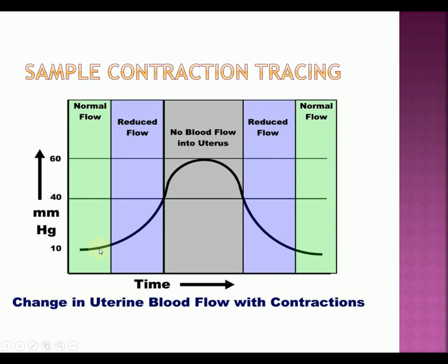Of course, if you were doing it by palpation, you would lay your hand on there until that contraction finished, starting from the beginning of it, and measure at least 2 to 3 contractions. So you might have your hands on her tummy for 5 to 6 minutes, depending on how often she's having contractions. This is also where you are able to feel the intensity of the contraction. And when we're doing duration, we're going from the beginning of the contraction to the end of the contraction.